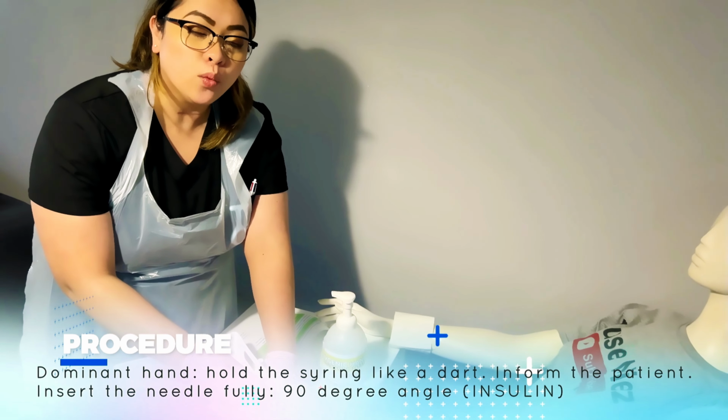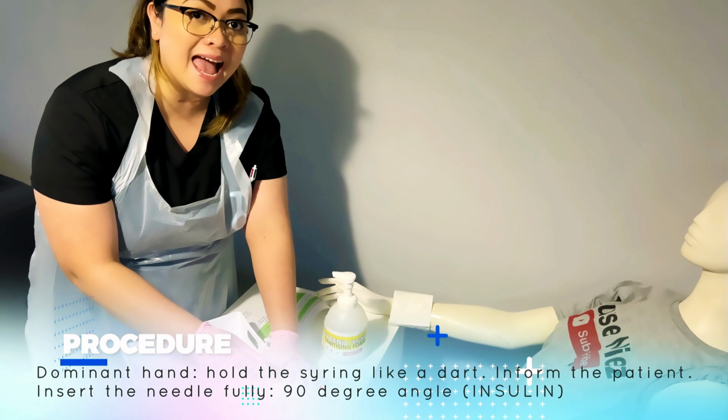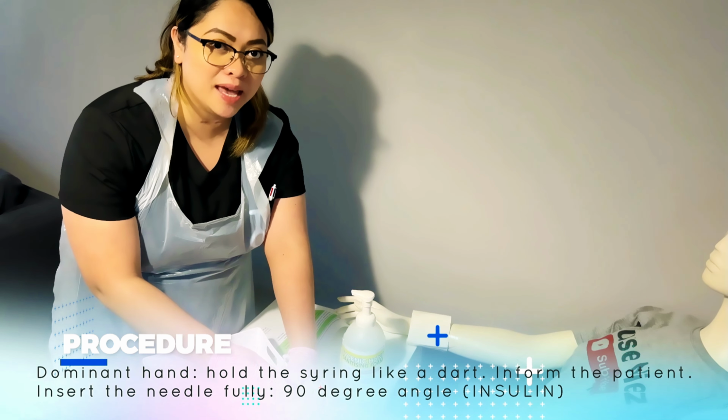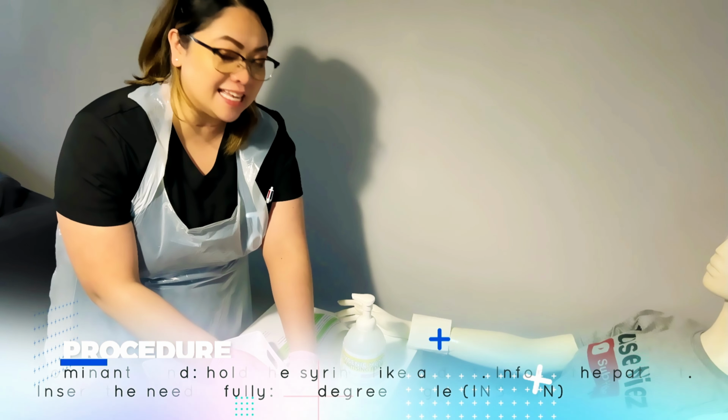Nurses, remember this: when you are giving insulin, it has to be a 90-degree angle, okay? But if it's any other medication apart from insulin, then it has to be a 45-degree angle, okay? Because it's subcutaneous. The only exception is the insulin, okay?